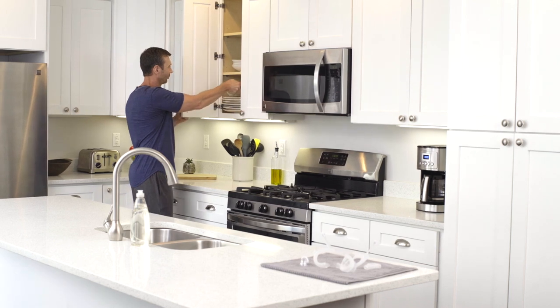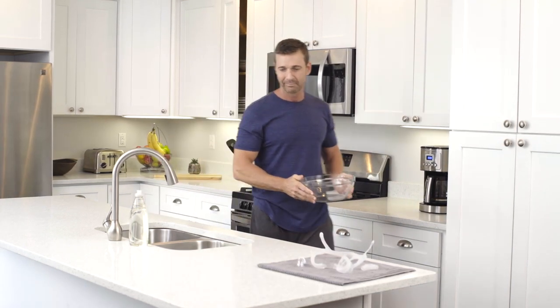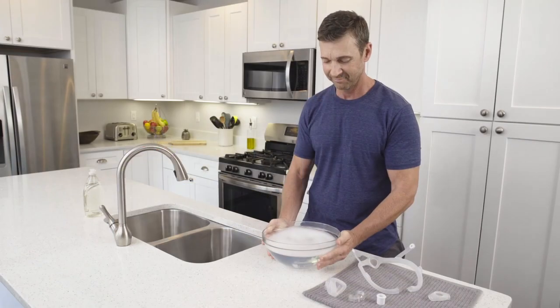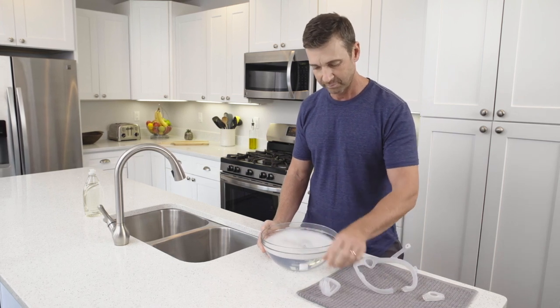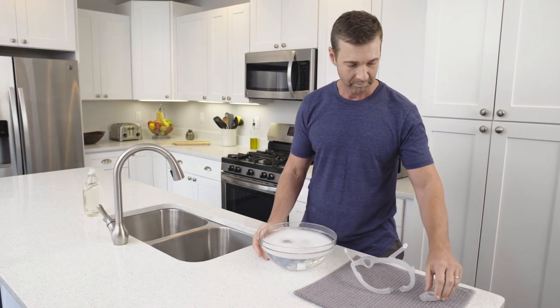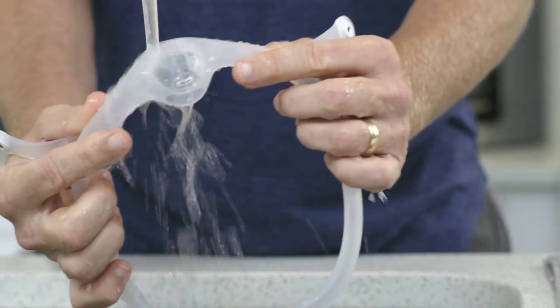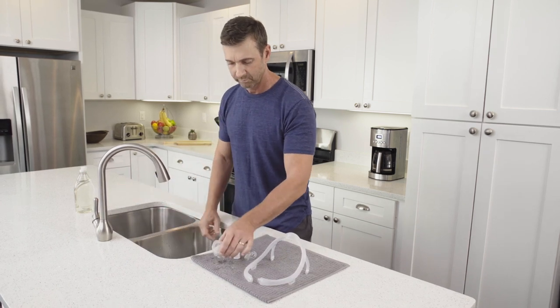Hand wash the non-fabric parts, the mask cushion, mask frame, elbow, frame size connector, and tubing quick release daily using mild liquid dishwashing detergent. Submerge the parts and examine them to make sure there are no air pockets present. Rinse the clean parts thoroughly with water. Let them dry completely before use.